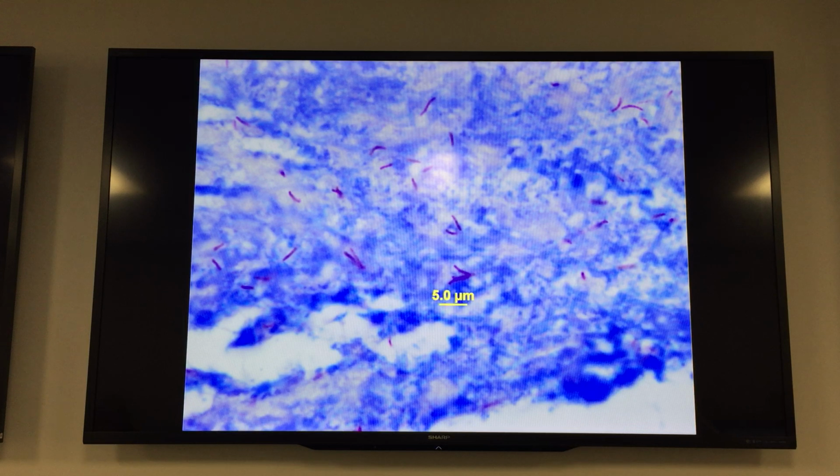Can you tell from looking at it whether it's TB or non-tubercular? No, impossible. Can you, Brenna? Do you think you can? We used to have some differential, long and slender. Yes, and I don't know if it is enough to base therapy on.